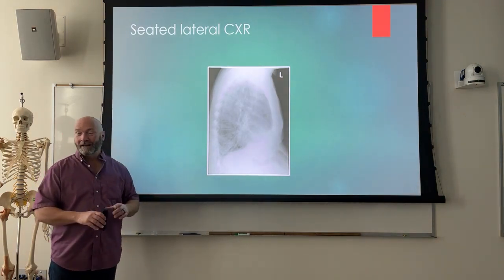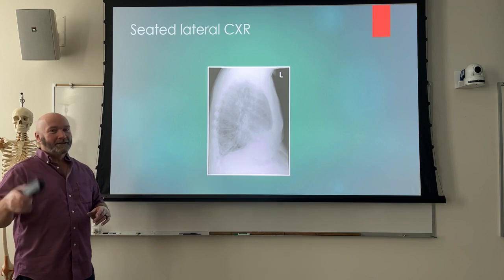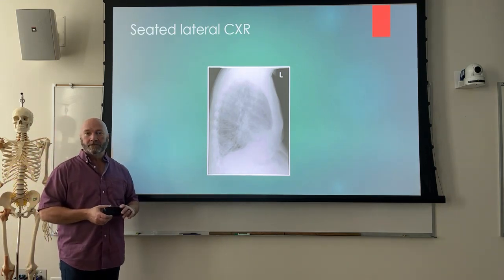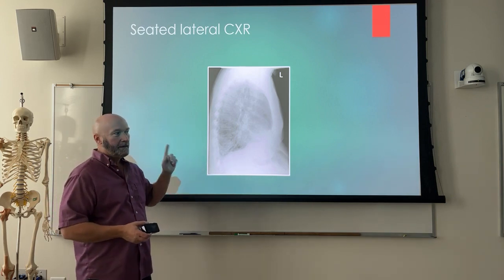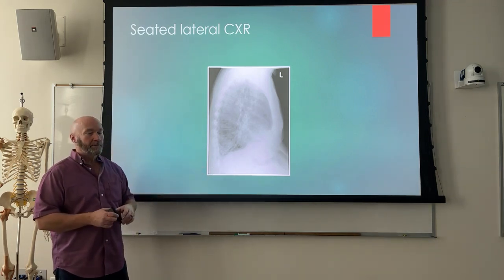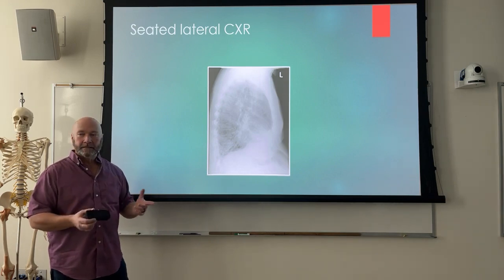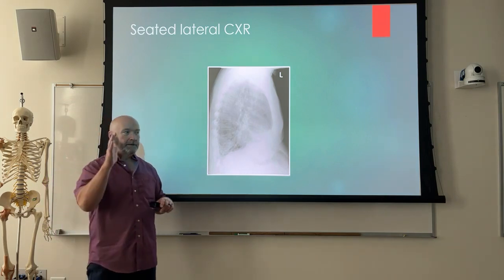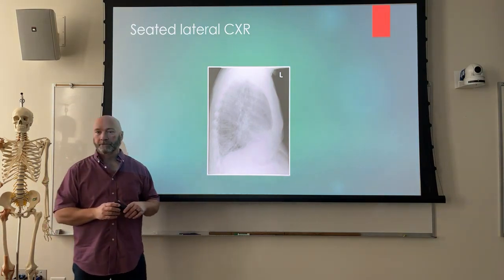You're going to find out as you get older, it ain't easy sometimes. All right, so you've got a sick patient, somebody who is so sick they can't stand up. You're going to do a lateral chest X-ray on the patient, and what you're going to have a tendency to want to do, because it's kind of industry standard, is to have the patient upright as much as possible, right?